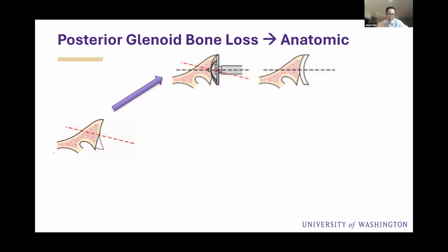So let's take a closer look at the options here when we have some bone loss posteriorly, which creates a biconcavity. If we try to ream the glenoid, we don't get complete seating. We'll run into issues with rocking horse loosening, as Kevin mentioned, and that's clearly not good to have an unsupported part of the polyglenoid that could lead to toggling and early loosening.